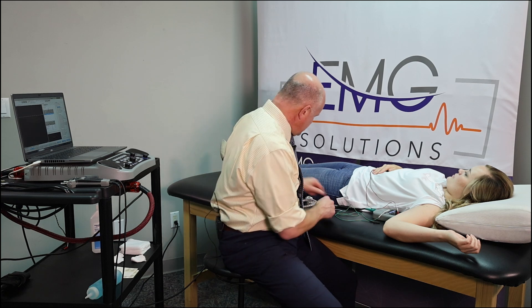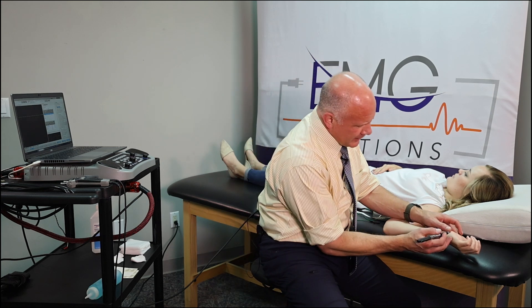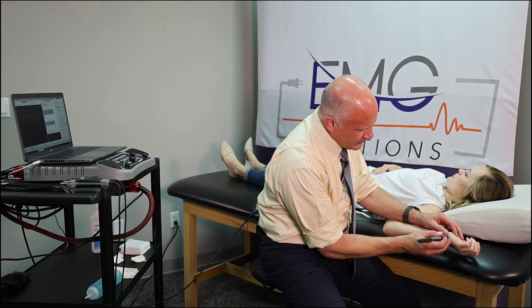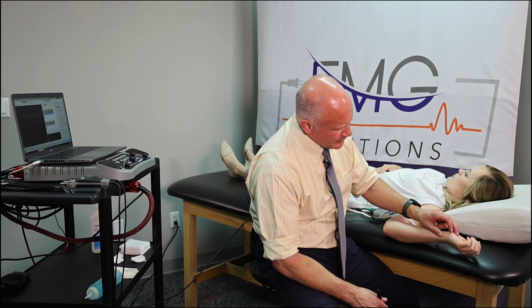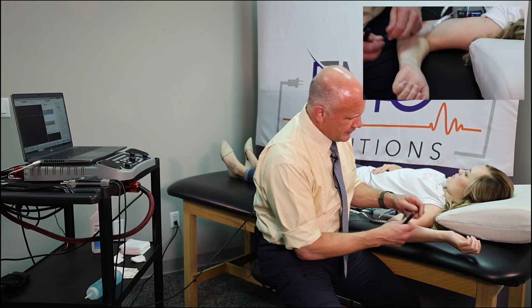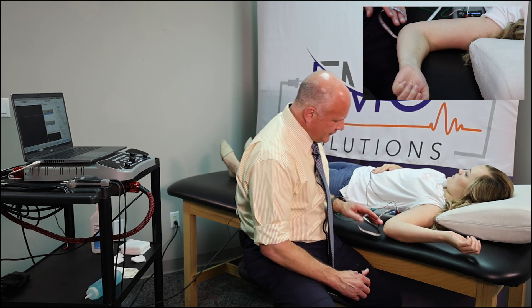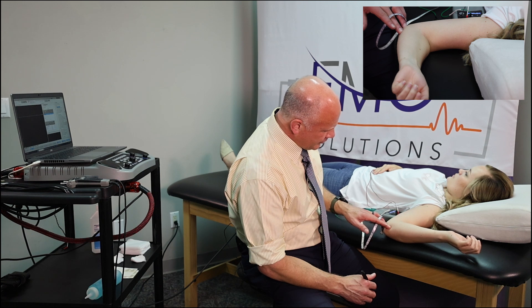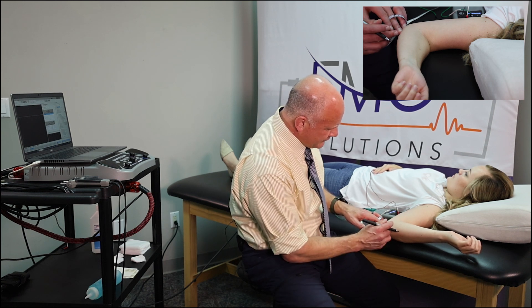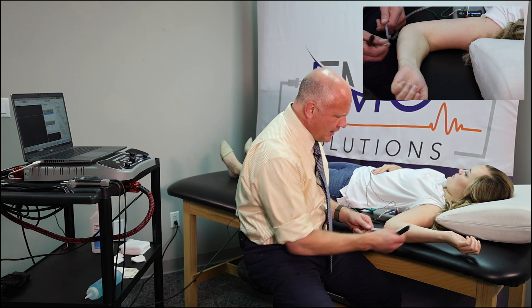Our objective today is to walk through the setup and testing procedures for this nerve. I'm going to find the muscle belly and mark it. It seems counterintuitive, but we tend to get a better result when we record not right in the middle of the belly but just in the proximal third of the muscle belly. Then I'm going to come back eight centimeters — that's what we use for our distal latency — and I palpate to find the medial epicondyle and appreciate the nerve as it comes out just before it dives underneath the flexor carpi ulnaris.